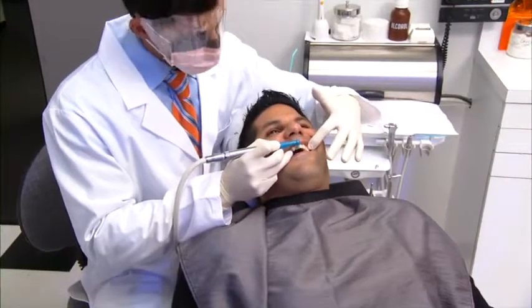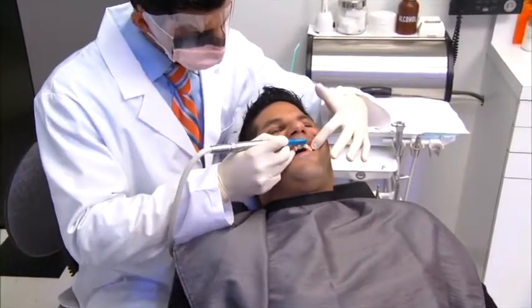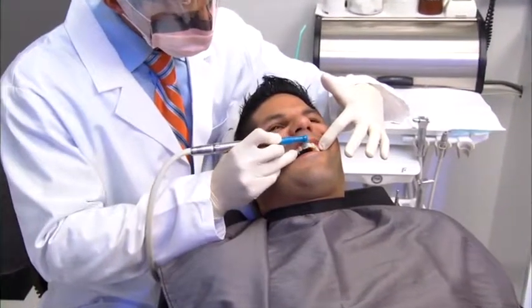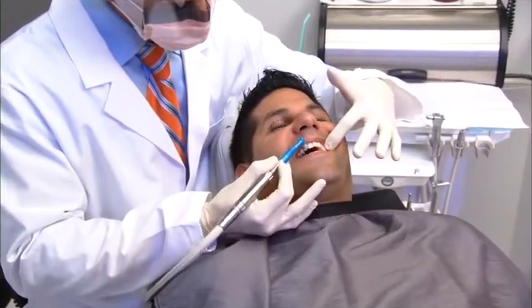Enamel should be free of moderate to heavy plaque and calculus buildup, preferably pumiced just prior to whitening. Patients that require root planing should wait 2 weeks before their whitening treatment.